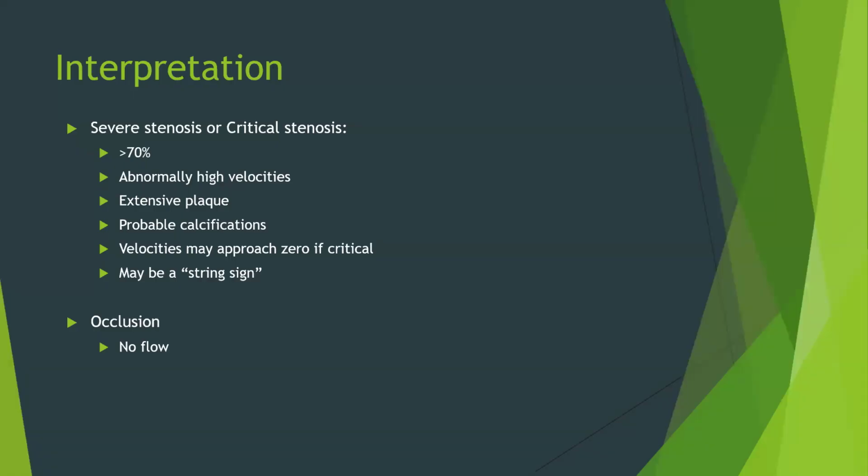So when we're talking about following up, say, less than 50% stenosis or a 50 to 69% stenosis, we're going to be following them up annually. And if they end up in that 70% range, it's probably going to take years to get to that point. And as Neil alluded to yesterday with DVT, same thing goes with carotid plaque. Okay, the longer that it's in the body, the more it's going to be calcified. So probably it's going to be a calcified plaque.